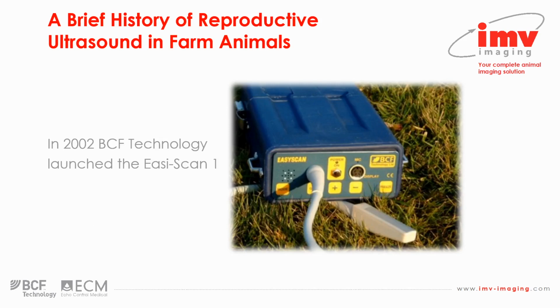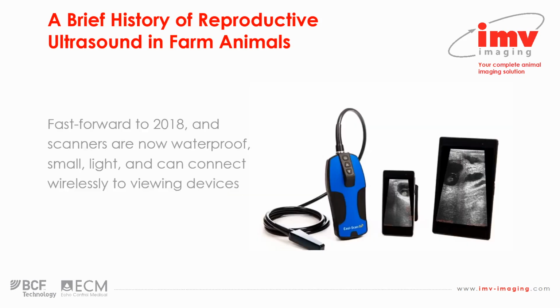As a company, IMV used to trade as BCF Technology, and BCF Technology in 2002 produced the EasyScan 1. So we can see here in this picture. And this is one of the first portable on-farm units that was ruggedized to work reliably in the on-farm environment.